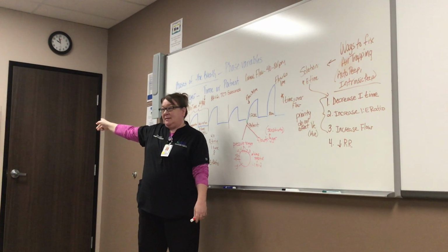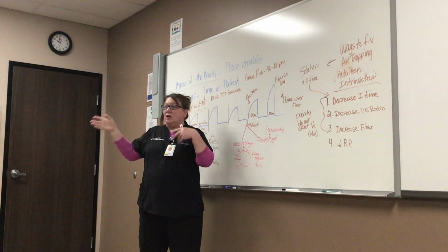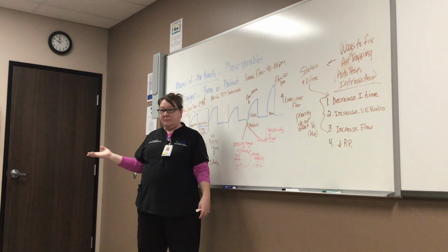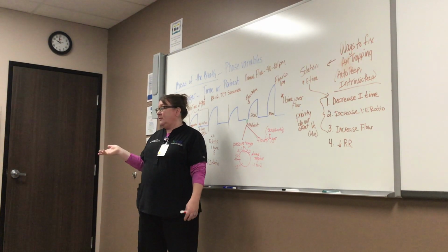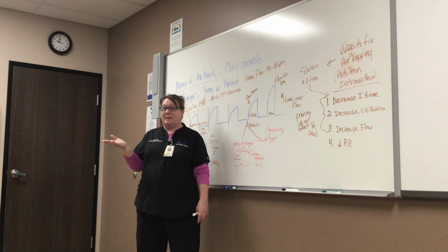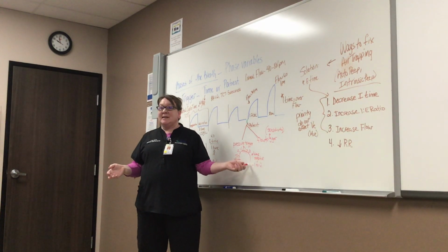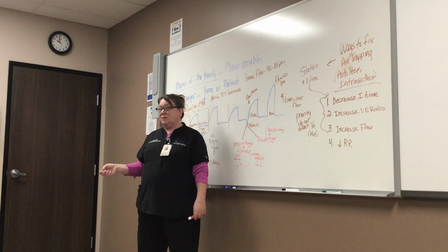Our test lungs in the lab make the vents auto cycle because they bounce all over the place and move around while you're using them. If you haven't noticed that, you will. You put your rate at 12 and it's going at a rate of 35, and you're like, why is it going at 35? This is not a human being attached. I set it at 12, it should be at 12. It's because the sensitivity makes it auto cycle, and that's what you see when something's auto cycling.